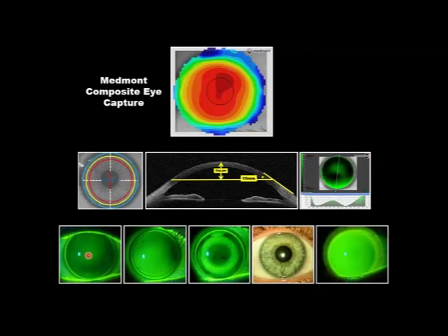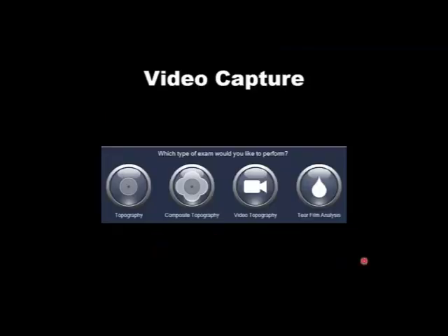You know, of course, today we're using more 10, 11 millimeter contact lenses, more larger diameter multifocals. Ortho-K lenses, typically a small lens is 10.5, so more typically we're using 11 millimeters. For our specialty custom soft lenses, understanding the peripheral cornea helps us to estimate the height of the anterior chamber. And that's true of scleral lenses as well, and more so than anything else. We want that peripheral corneal information to build our scleral lenses.